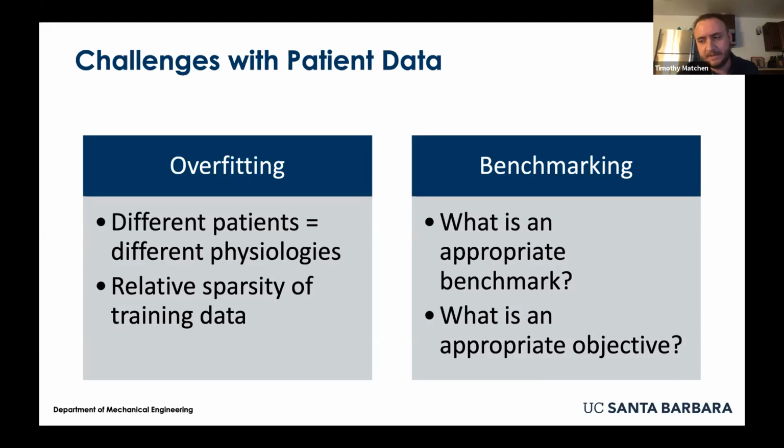So this can be as simple as just different kinds of readings in the local field potential, different responses to actually having the deep brain stimulator implant placed in the brain, because it might be in slightly different locations relative to the STN, or the progression of their PD might be slightly different, things like that.